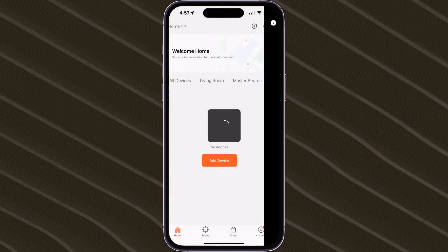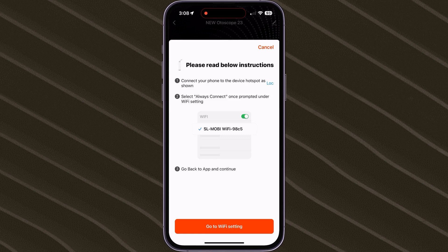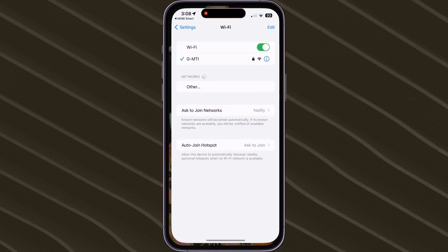Once connected, hit Done on the top right corner. After scanning the QR code, tap on Go to Wi-Fi Settings at the bottom of the screen.